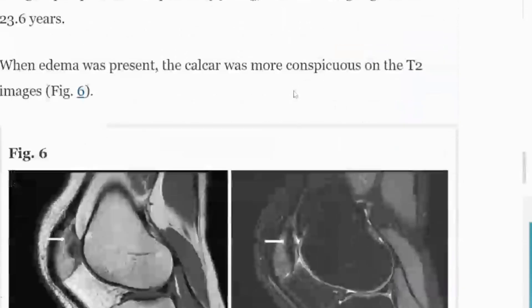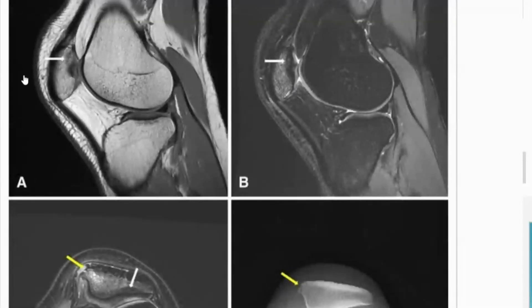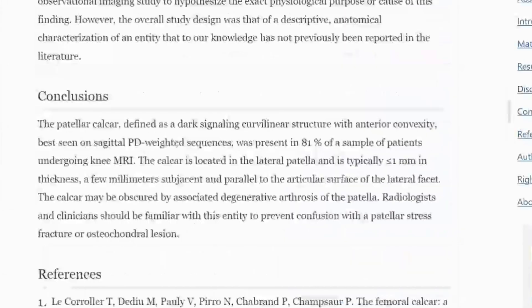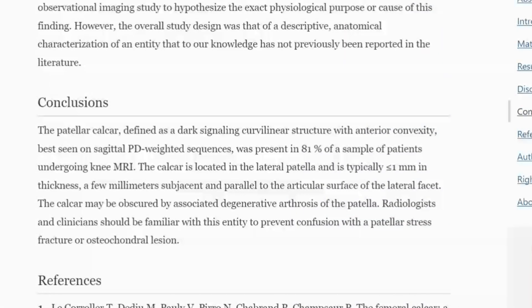Just another case showing the differences. It is located in the lateral patella. So I hope this was helpful. Next time you see this, you don't have to worry, you don't have to look it up — you just know it's a normal finding, don't worry about it, don't even mention it. If somebody asks you, you can be very quick and reference that paper.